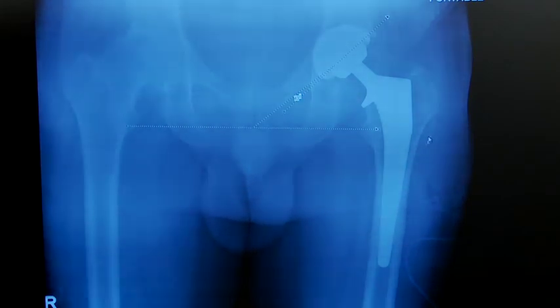Stem looks good, it's lined up well, I don't see any obvious fractures, everything seems to be fitting him quite well.